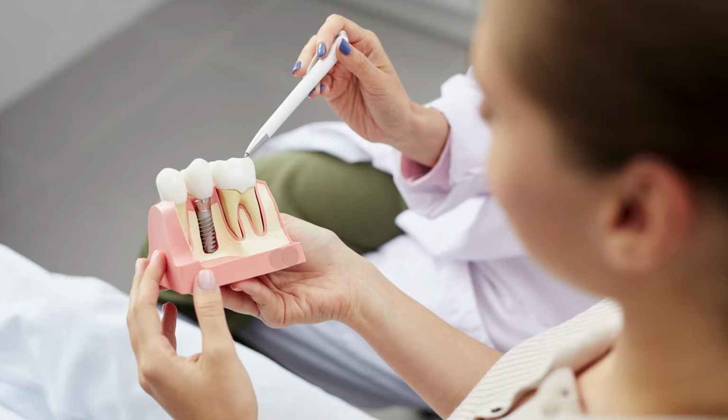All right. Well, my final question for you is just, are mini implants appropriate everywhere in the mouth? Yeah, I think that's a good question too. I think all implants are bone driven, so it depends upon the amount of bone that you have. What happens when you lose a tooth primarily is you lose probably 60% of your bone. And so it makes it more difficult to place implants.